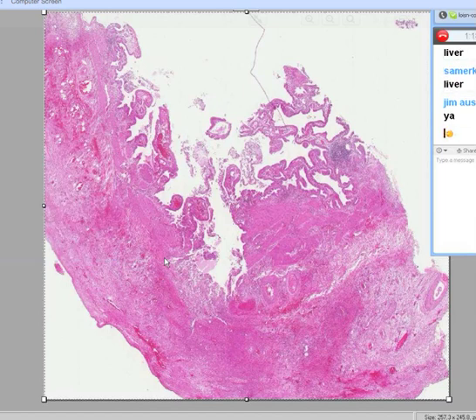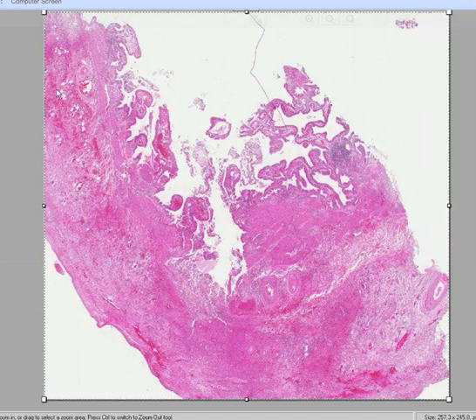Folks, what if I told you that this was a GI organ as well? The first thing you would say is, well, I could see kind of like a glandular mucosa, and I could see a lumen over here. And then I see some irregular, smooth muscle that looks dark and light, and there's a lot of vessels. And you would probably say, gee, it can't be an esophagus. It doesn't have the lamina propria like you see in a small bowel or a large bowel. It's definitely not stomach.